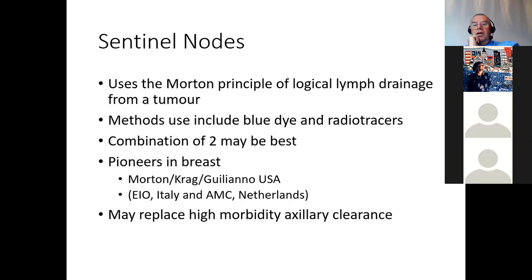So they'll do the radiotracer, and then they will do the blue dye just before the operation. The reason is the blue dye shows up the tracks very nicely, which makes it easier to do the intraoperative probing. If you think of blue dye as showing up your motorways, and then your radiotracer shows up your service stations, I'm particularly thinking of that road between Joburg Airport and Pretoria, which I used to travel fairly frequently.